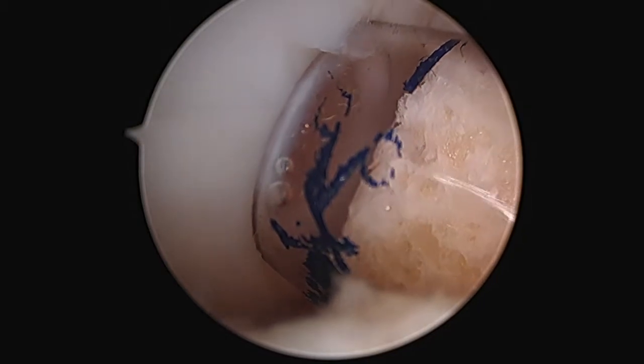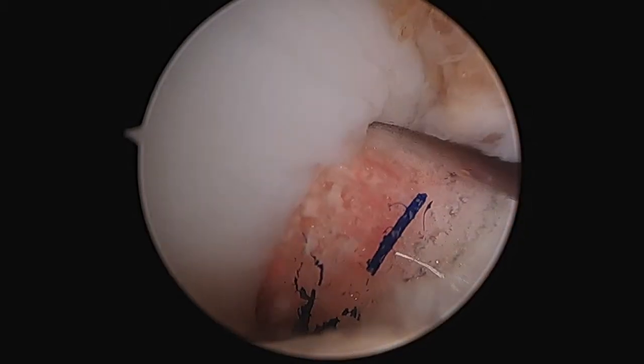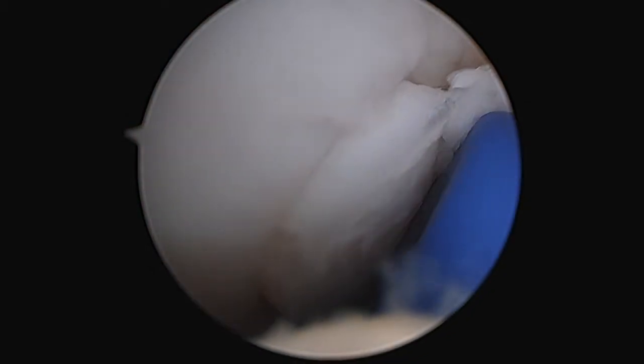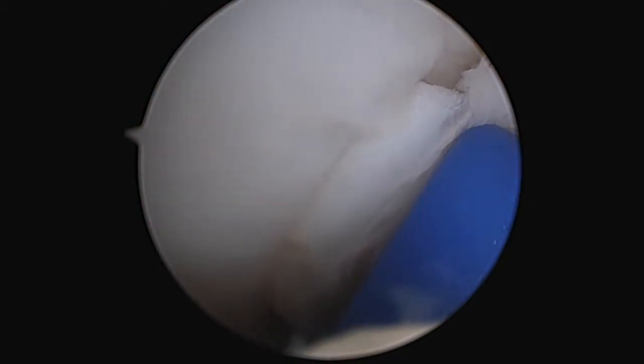I am transferring it in through the same clear Arthrex cannula and now I am impacting the plug into the lesion site. I then use a tamp and tap it down making it flush or slightly proud so it does not subside.